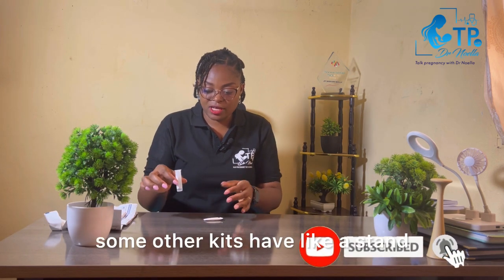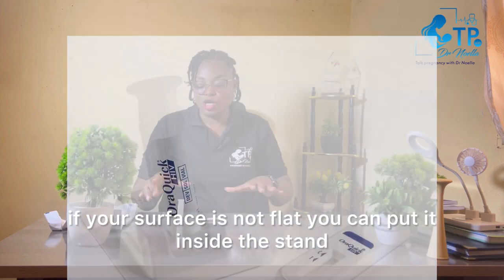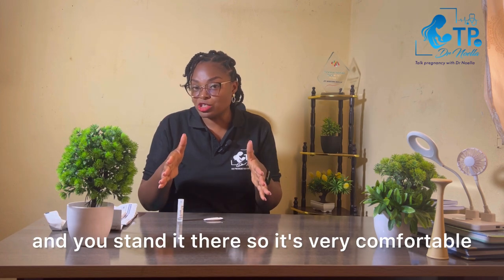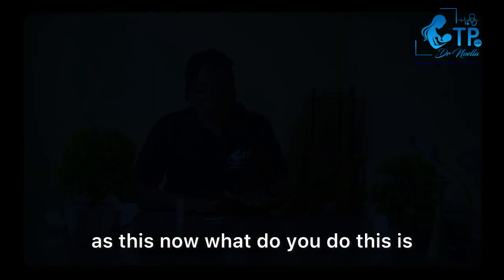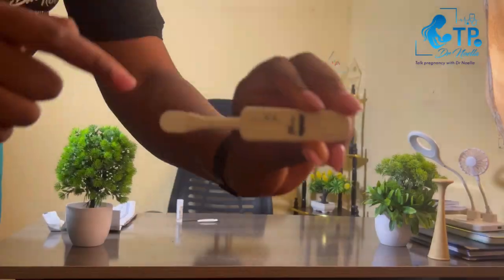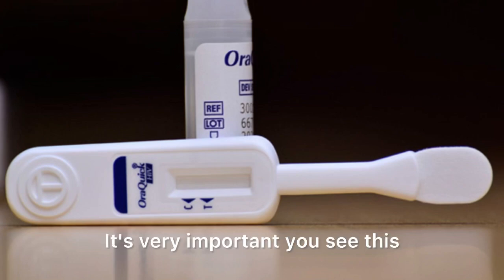This liquid here is not water — please don't decide to empty it and put water in. It looks like water but it is the solution that does the testing. Some kits have a stand where you can place the tube if your surface is not flat, so it's comfortable while you're doing the test. If you look at the tube, you'll see the test line and the control line — it's very important you notice these.